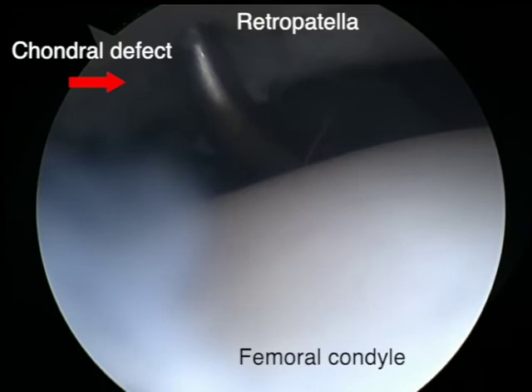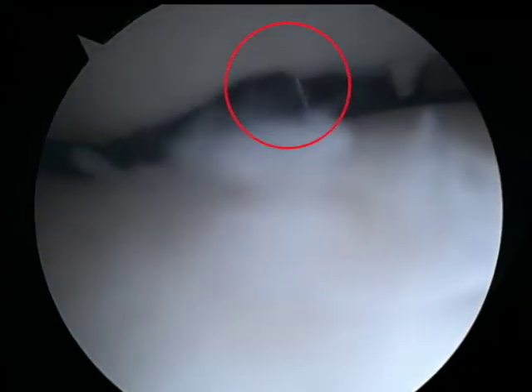The same problem is presented when a shaver is used as well. In this third clip, a 70 degree awl is being used to attempt the micro fracture, but because of the instability of the patella, the awl can easily skive off the site of the lesion.